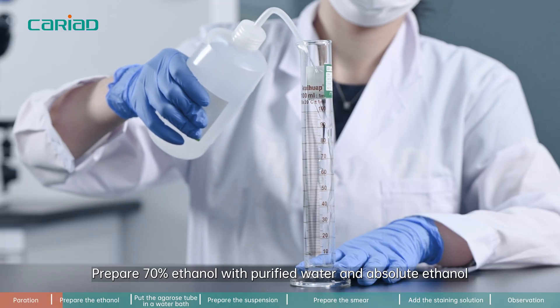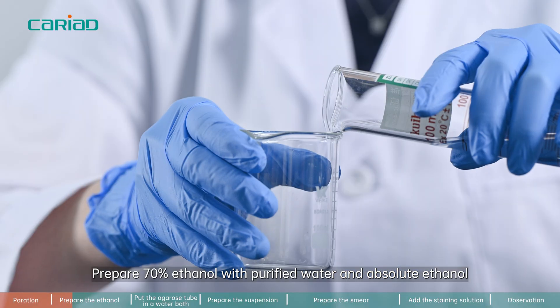Step 1. Prepare 70% ethanol by mixing purified water and absolute ethanol.